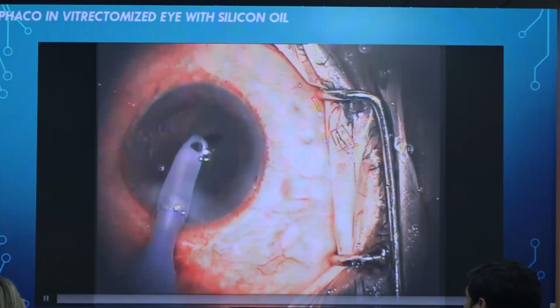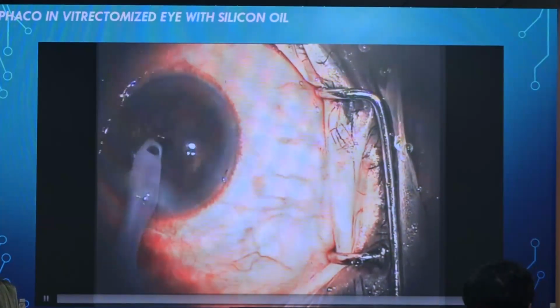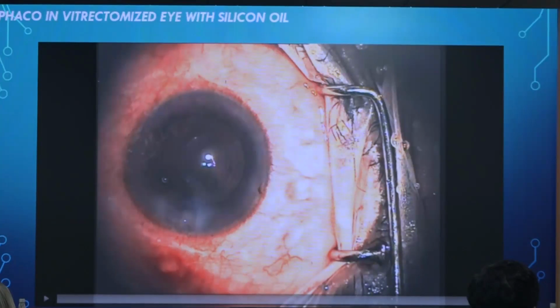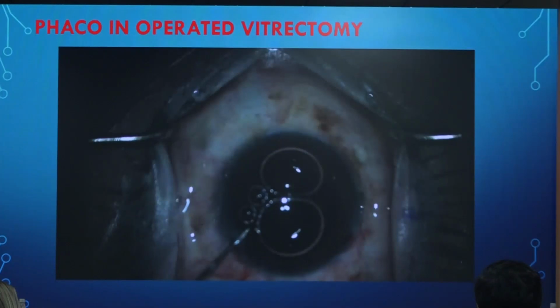It becomes very difficult for us to remove this plaque, so better leave it there. Don't fiddle around with this. Don't try so that our patient on day 1 or day 2 should have good 6/6 vision. There's another similar video, I'll skip that.